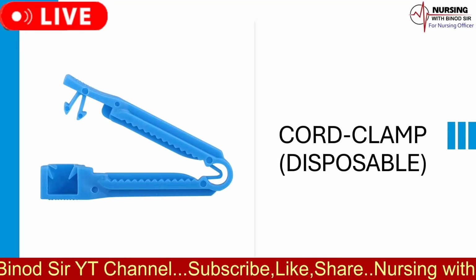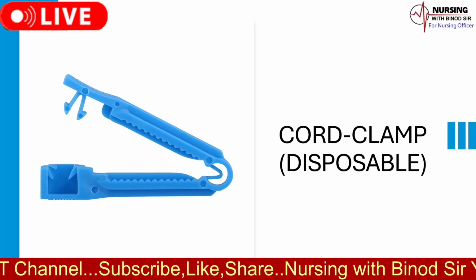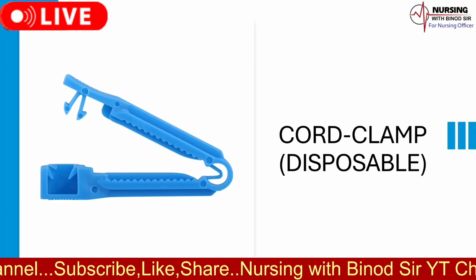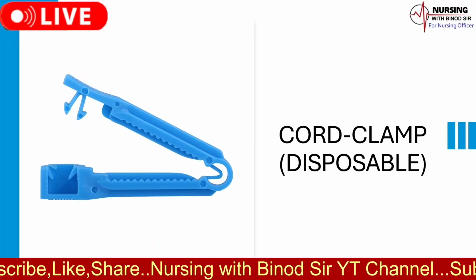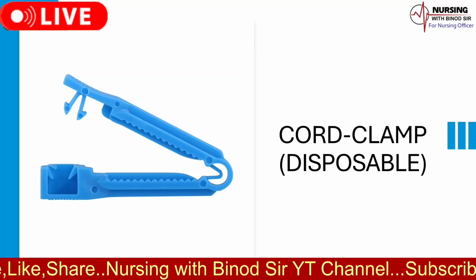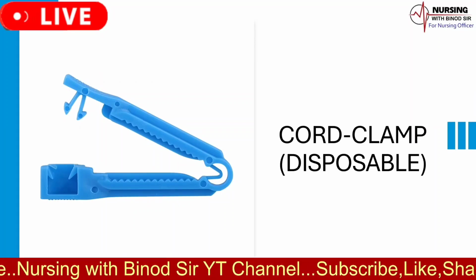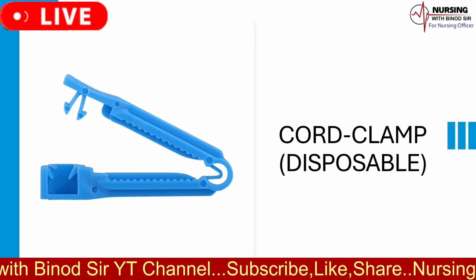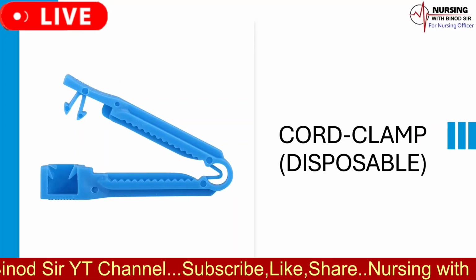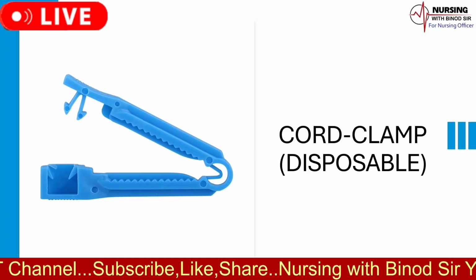In delayed cord clamping, they are used after a specified period post-birth to allow additional blood flow from the placenta to the baby, providing extra nutrients and iron. 4. Securing the cord. Used in securing the cord stump safely, minimizing the risk of infection. 5. Postpartum hemorrhage control. Helps in managing postpartum hemorrhage by ensuring any excess bleeding is controlled during childbirth.